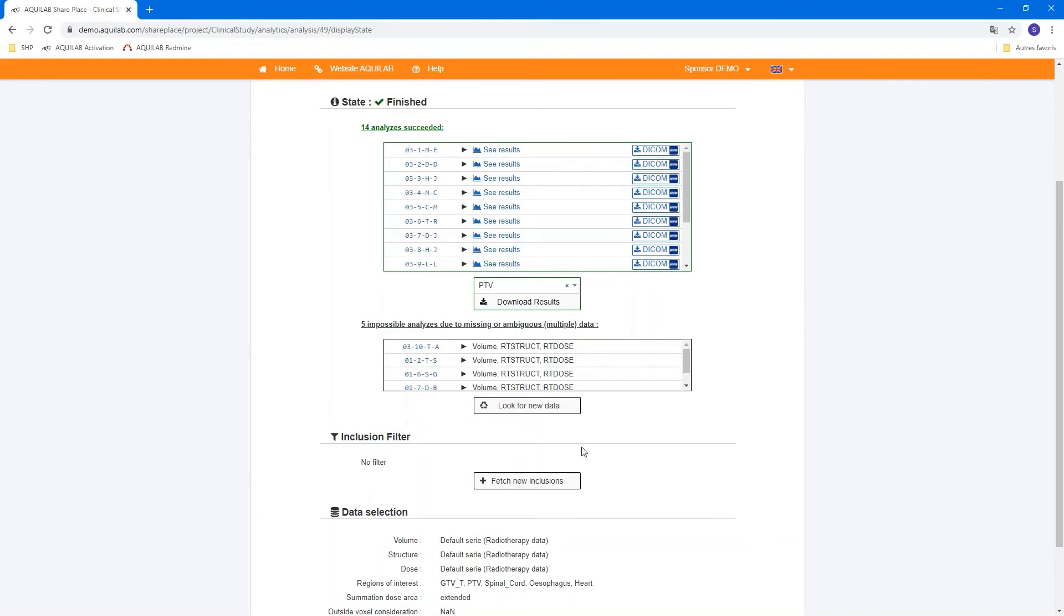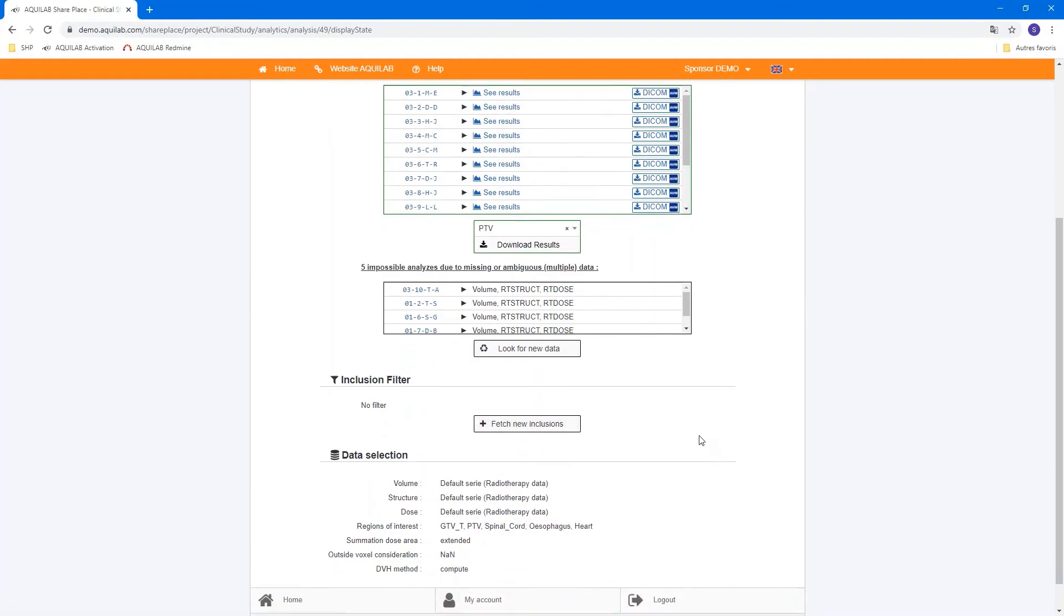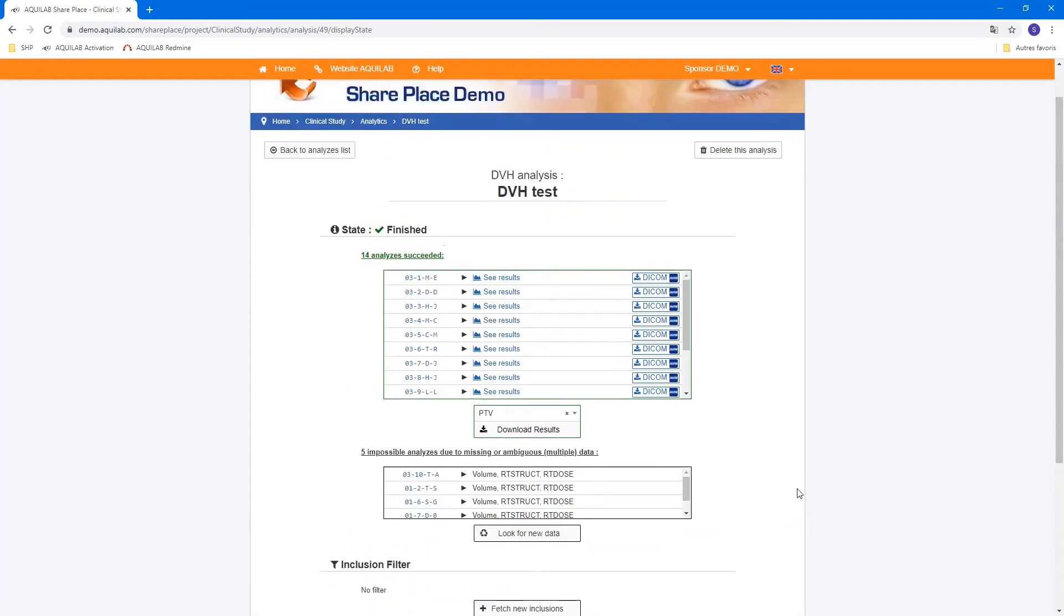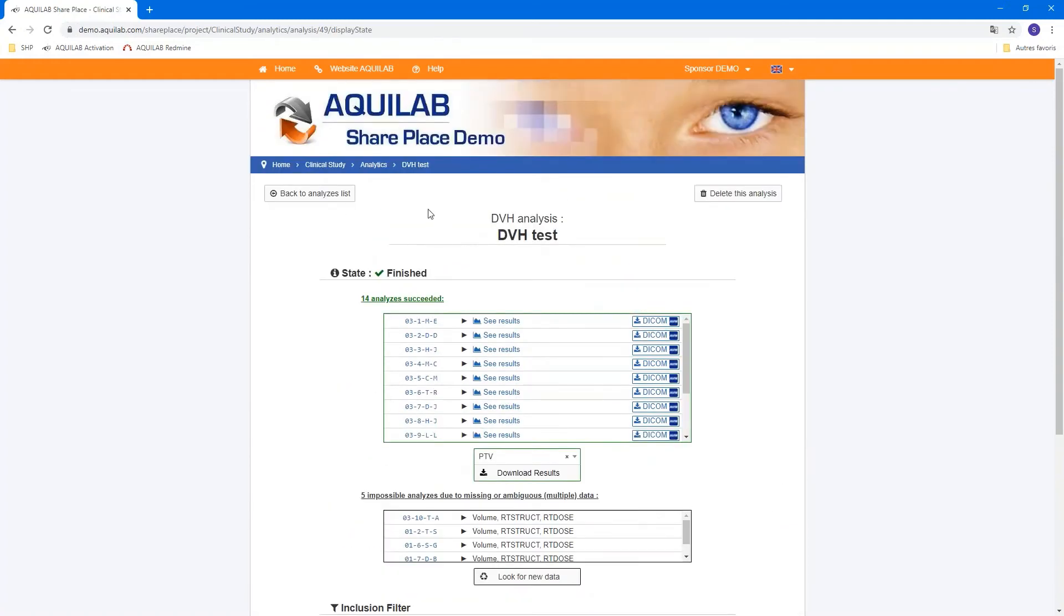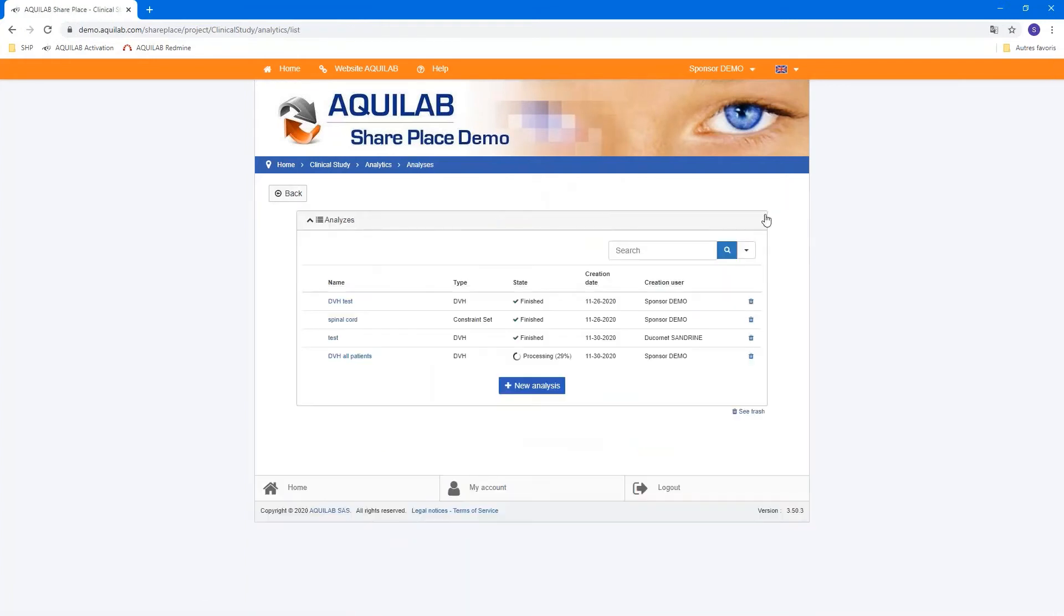If you made this analysis during the study, you can fetch new inclusion in this analysis to add the new patient including in the protocol. And at the bottom of the page, you have a summary of selected data.